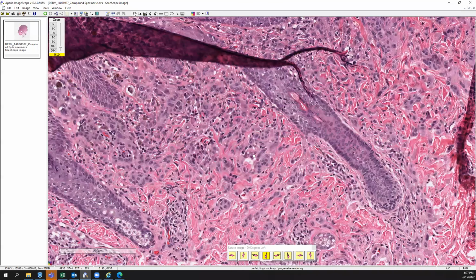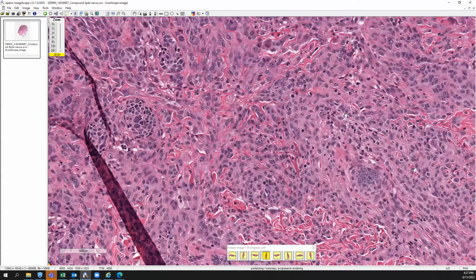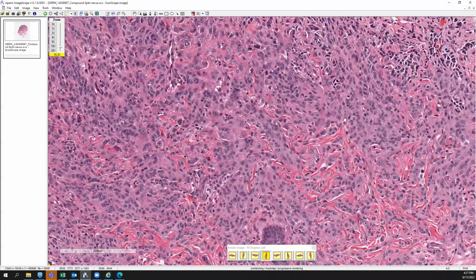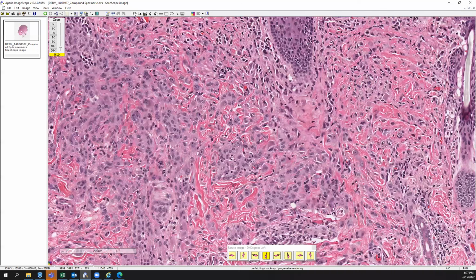There are some nice papers out there that you can look at. Lezcano et al. have done a great job at researching PRAME. If it comes back diffusely positive in a lesion like this, you'd want to definitely do molecular testing. If it comes back negative and the other stains are reassuring along with the histology, then you should feel pretty good about it.